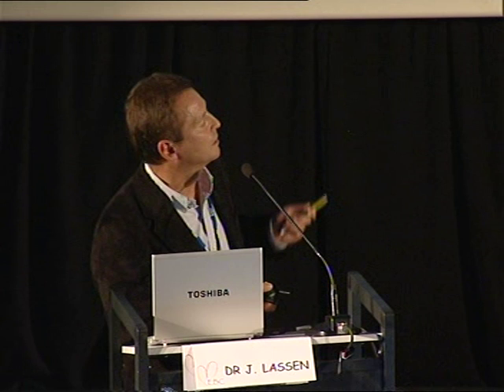So we put in a filter wire and tried to loosen up some of the material by balloon angioplasty. I have to admit that I did the procedure myself, and you will see one of the big mistakes you can do — when you have an inflated balloon and try to retract it in a vessel which is not totally evacuated. Because the next slide shows the problem: there was a severe proximal embolization threatening the healthy circumflex. I tried to make some thrombectomy with the export catheter and succeeded in removing some of the material, but the rest wouldn't disappear.